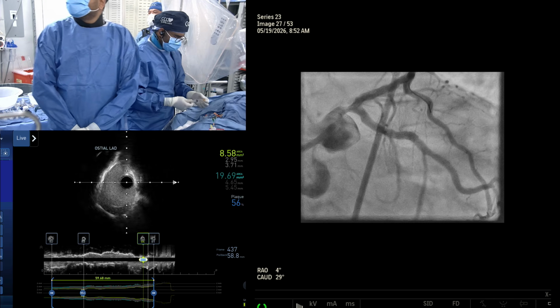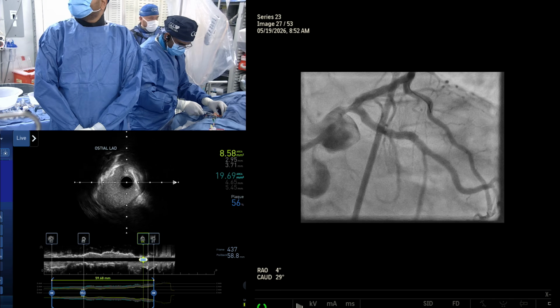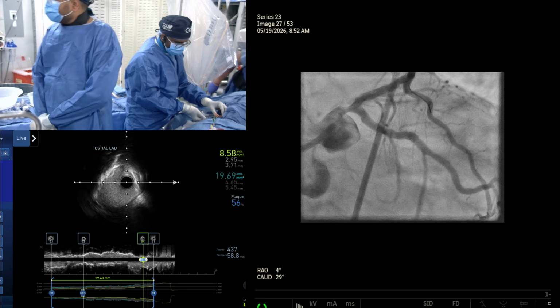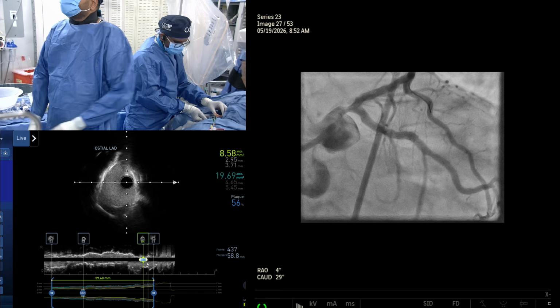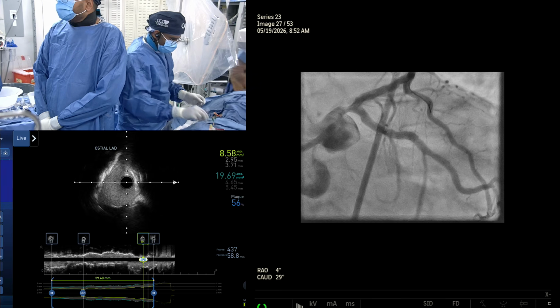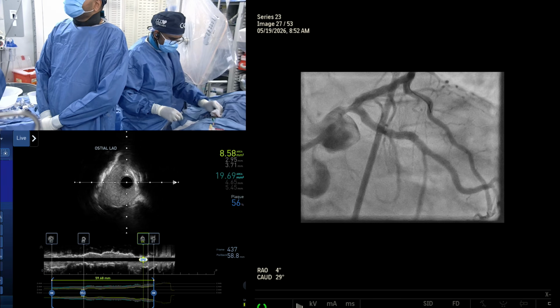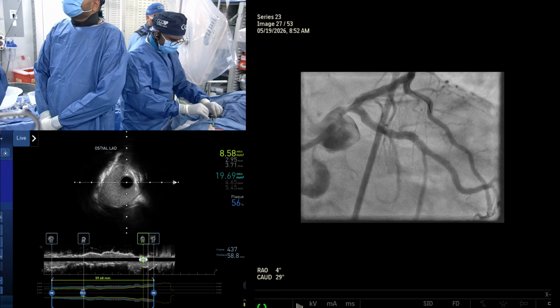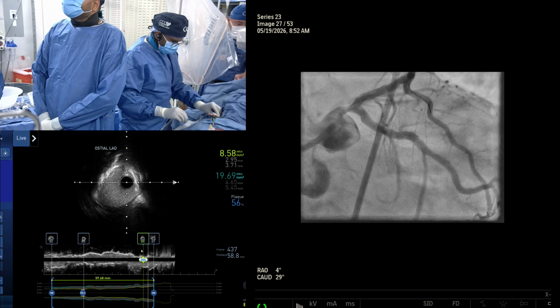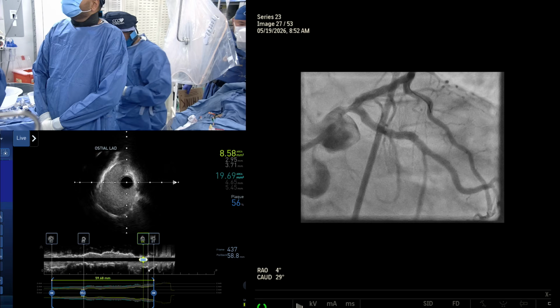This is what all the randomized trials of intravascular imaging have shown. No matter how good you are, how much is the protocol, in about 42 to 50% of cases you do not get all the components of your optimal stent, like minimum cross-sectional area and so on and so forth. And here, in this case, the question always comes: would you have delivered 8 pulses instead of 4 in that area? Would the outcome be different from what we have now? Kiski, tell a little more on the ostium.